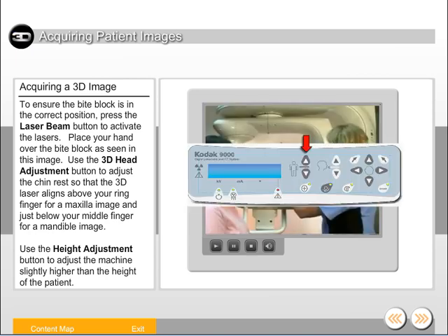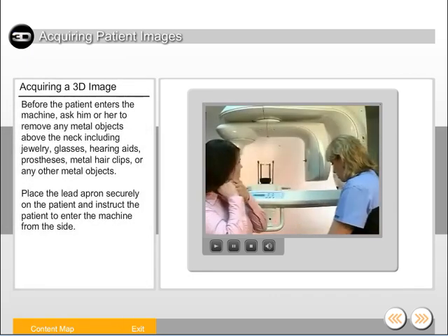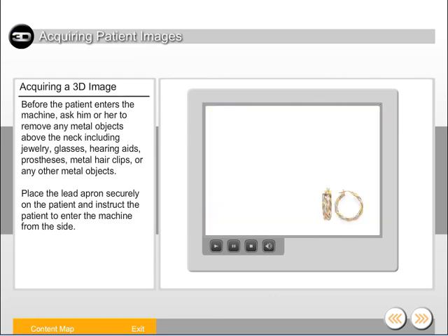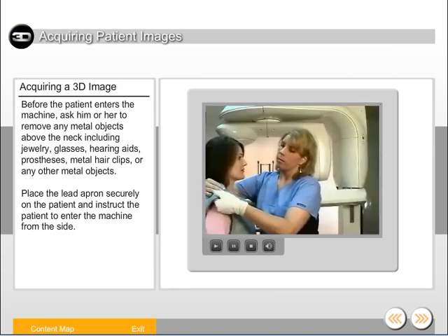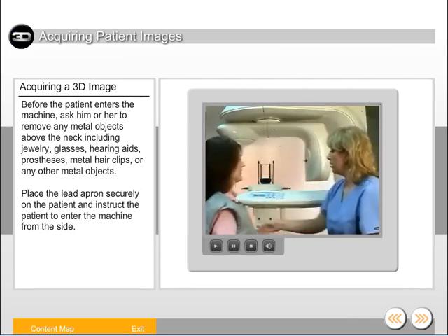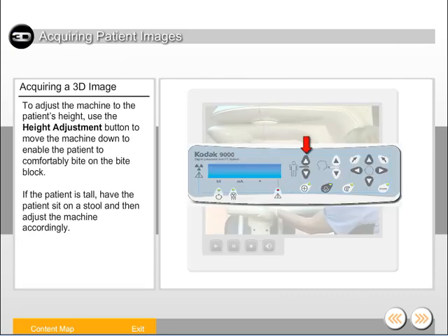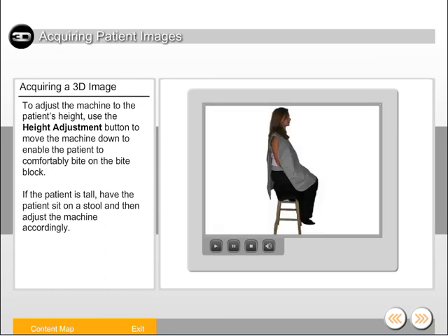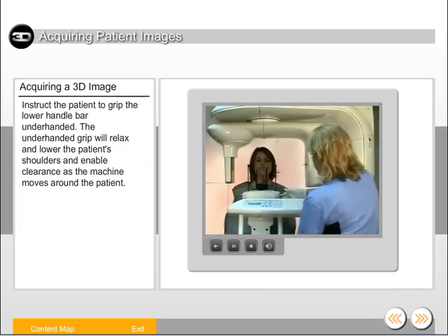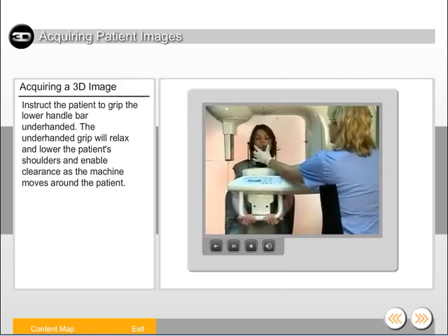Use the height adjustment button to adjust the machine slightly higher than the height of the patient. Before the patient enters the machine, ask him or her to remove any metal objects above the neck, including jewelry, glasses, hearing aids, prostheses, metal hair clips, or any other metal objects. Place the lead apron securely on the patient and instruct the patient to enter the machine from the side. Use the height adjustment button to move the machine down to enable the patient to comfortably bite on the bite block. If the patient is tall, have the patient sit on a stool and then adjust the machine accordingly. Instruct the patient to grip the lower handlebar underhanded — the underhanded grip will relax and lower the patient's shoulders and enable clearance as the machine moves around the patient.